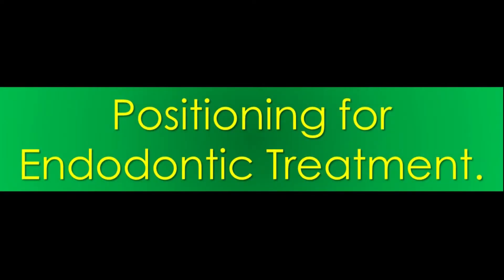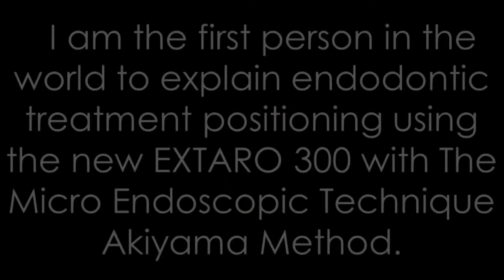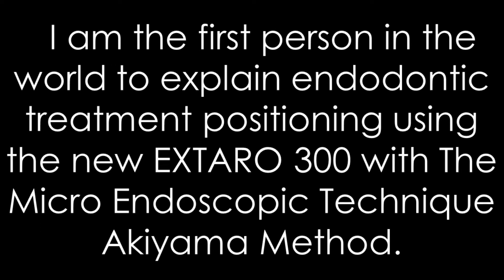Positioning for endodontic treatment. I am the first person in the world to explain endodontic treatment positioning using the new EXTARO 300 with the micro-endoscopic technique Akiyama method.